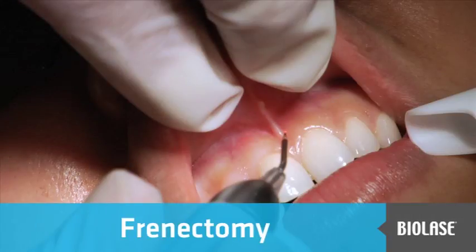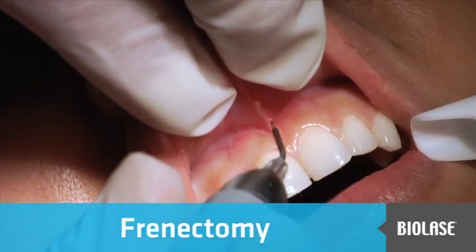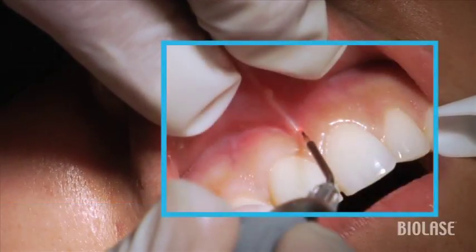This patient presents with a strong labial muscle pull, and so what we can do is using the frenectomy setting of the iLase, dissect the frenum from the attached tissue.